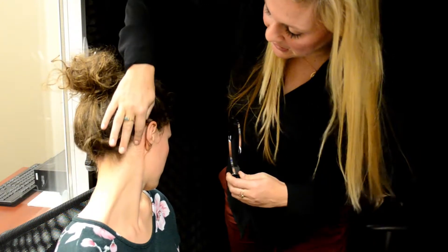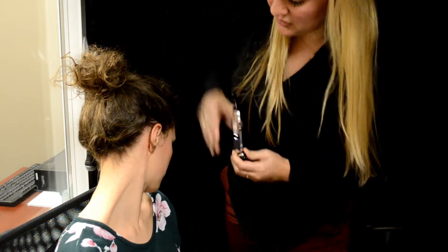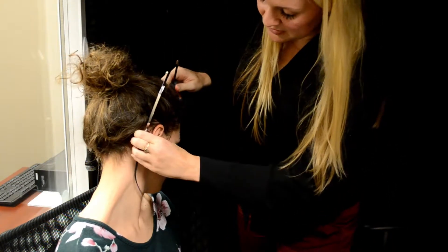Now that the patient has her ears unobstructed, we're going to go ahead and put on the bone oscillator. If we're doing mastoid, you want to make sure that you put it behind the ear to where it's not touching the ear, so we're going to place it on the mastoid bone.